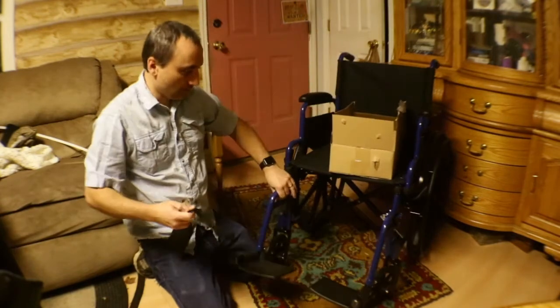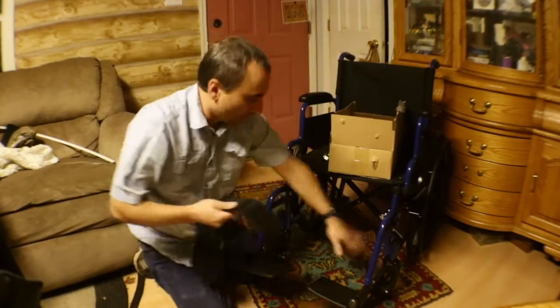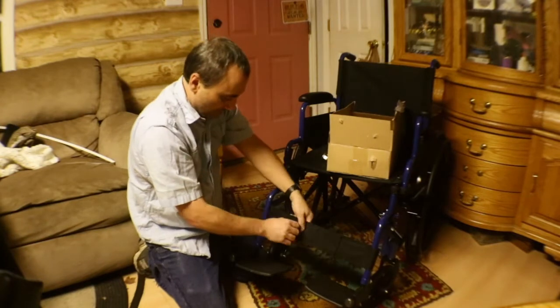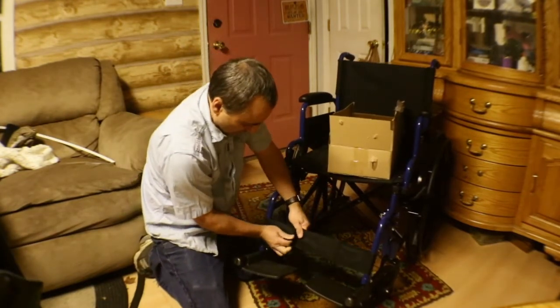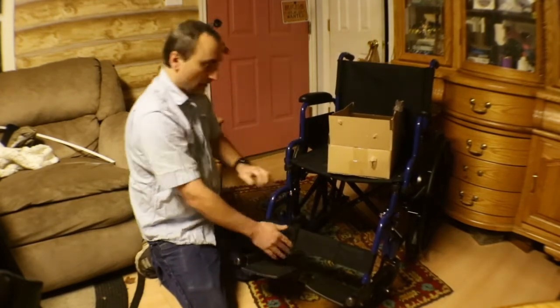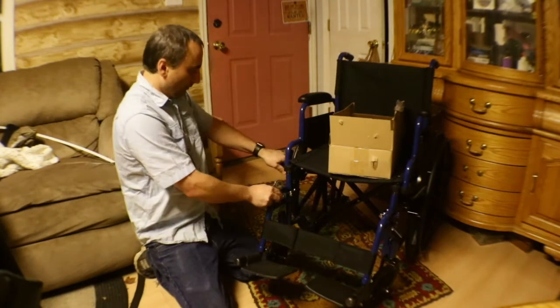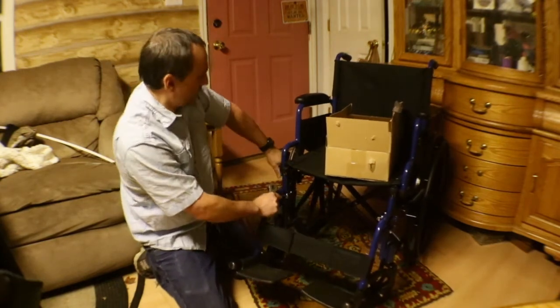It does come with a rest for your calves so you're not fighting to keep your legs up — gives them something to rest on. It also comes with a tool, and it does have locks on the side to lock the wheels. Those are good.